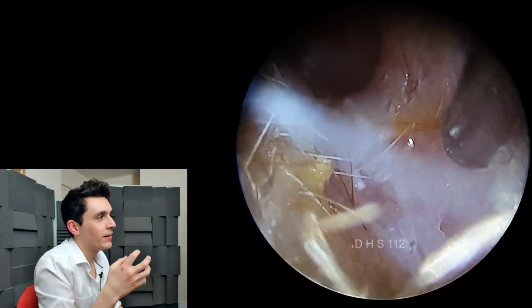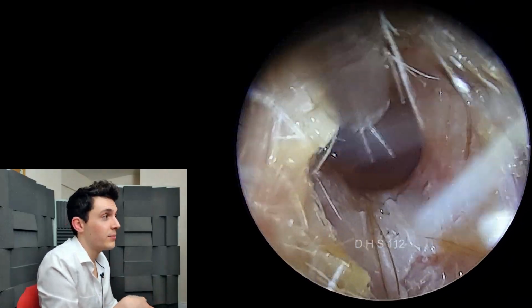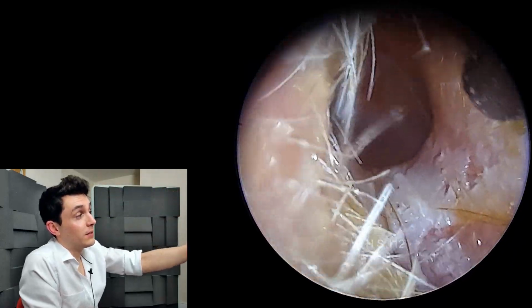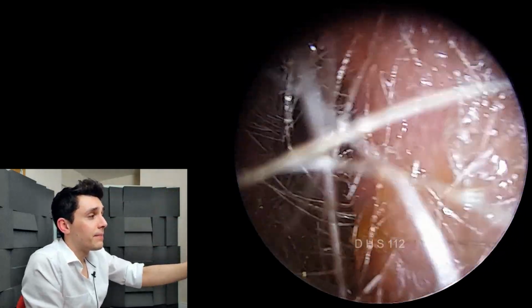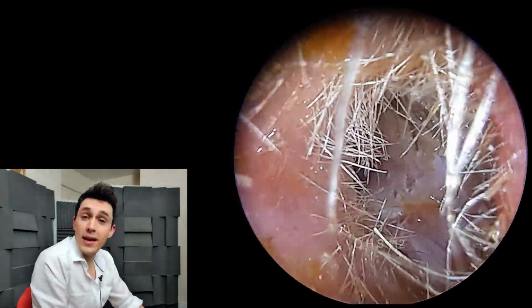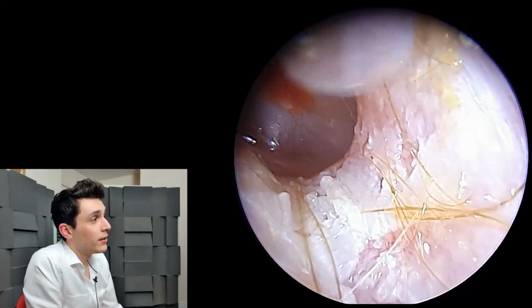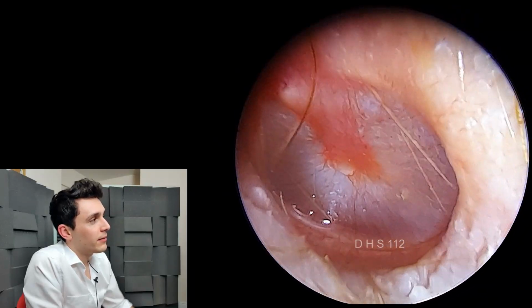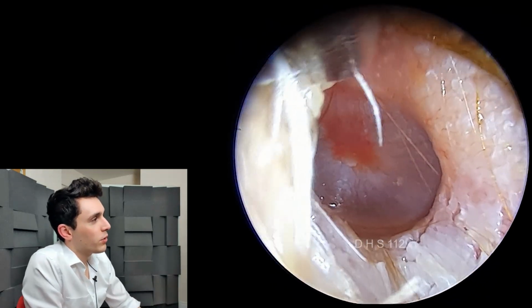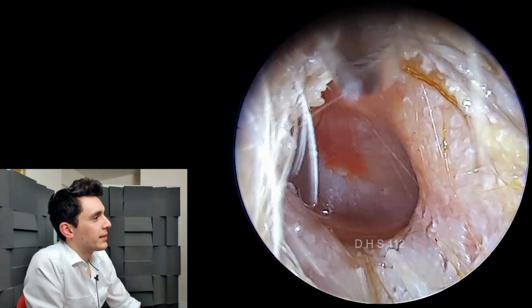And right here I could feel him clenching a little bit, which means that he's finding it uncomfortable, which means that I'm applying too much pressure, so I'm being heavy-handed, which ultimately means that that's a little bit too difficult to get. But nevertheless, from where we started, it's a fairly good outcome. Most of the dead skin is gone, and the ear canal is looking very clear. Lovely red-looking eardrum there, but I don't think that's anything to worry about. And again, just catching a little bit more dead skin here.